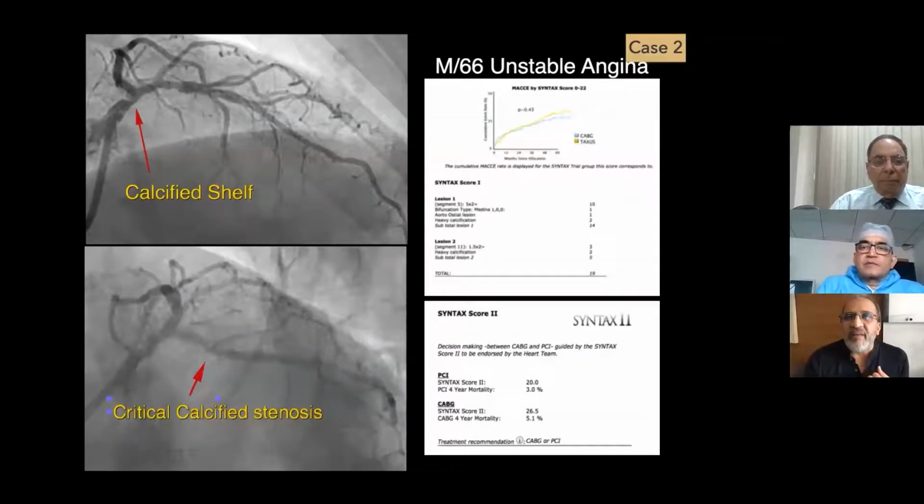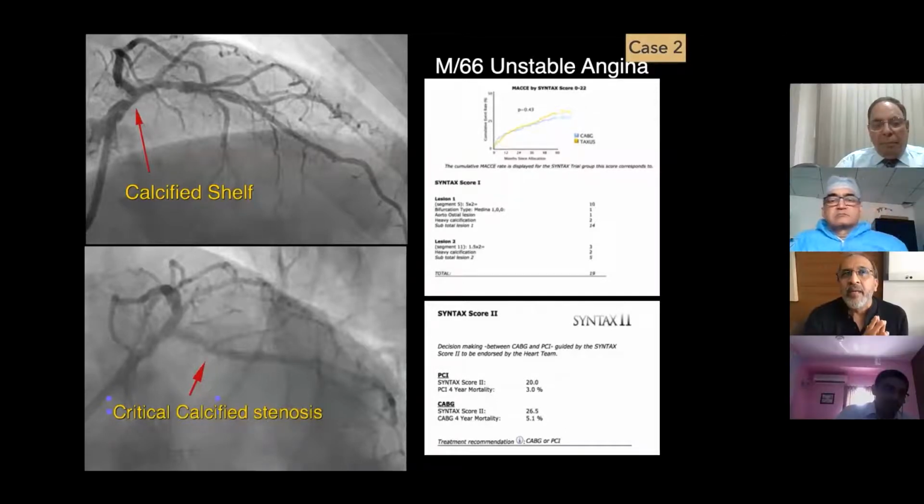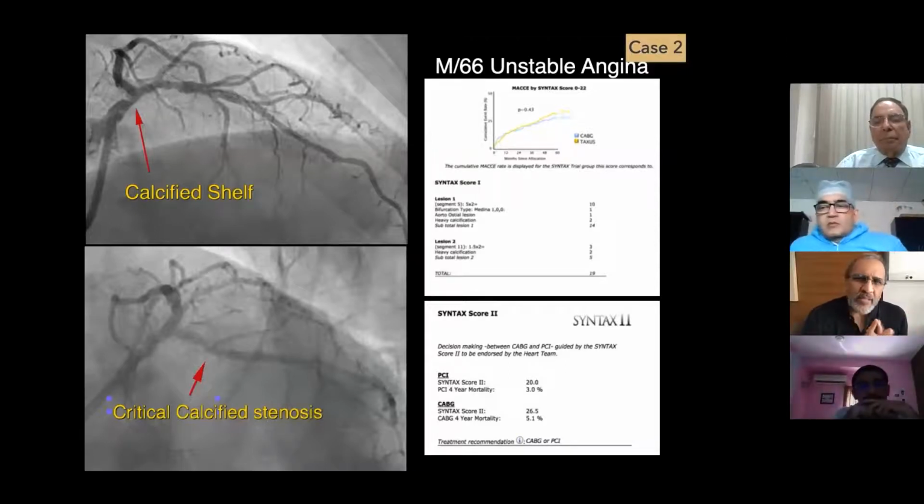Similarly, in this left main, you can see that sometimes we can use these images. If I look at these images, there's a distal left main, there's LAD extension, there's circumflex, which is critically narrowed in the proximal segment. And most of the times, 20 years ago, I would just go do rotablator in both these arms and put stents in both these arms.